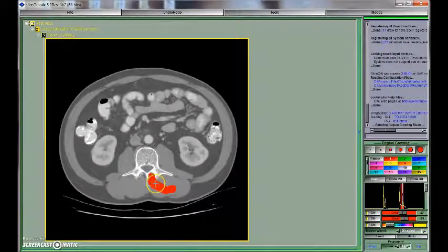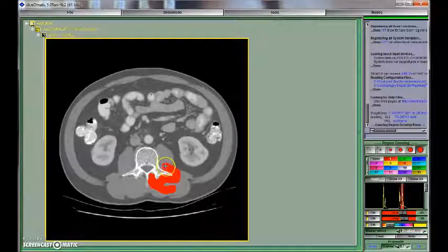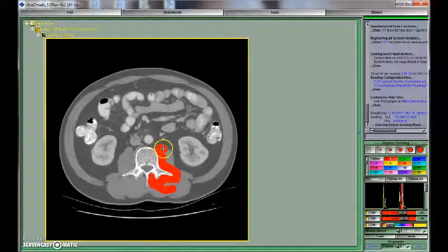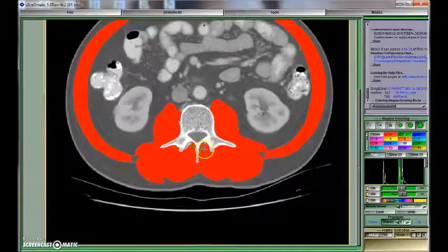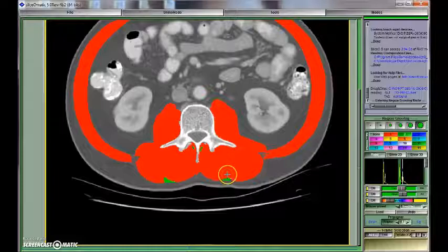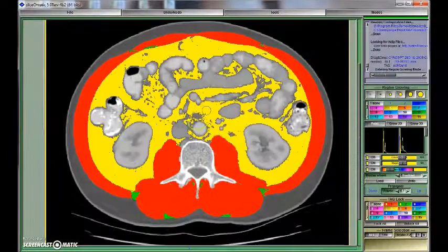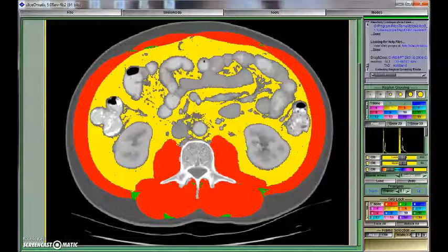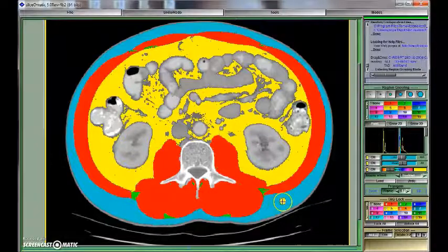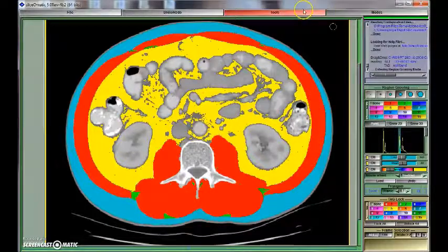The next step is to select a brush size and to manually identify each tissue at the pre-specified corresponding color. Now we are coloring the skeletal muscle. Next we color intramuscular adipose tissue. Here is how selected areas of visceral adipose tissue will look like for this image, and finally subcutaneous adipose tissue.